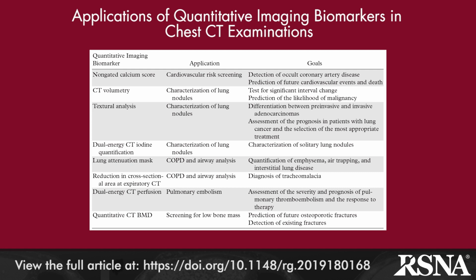Given that chest CT studies encompass an anatomic region responsible for the top 3 causes of mortality in the United States, namely ischemic heart disease, lung cancer, and COPD, the use of biomarkers derived from chest CT examinations holds great promise. The biomarkers discussed in this article are summarized in the table at the beginning of the paper.